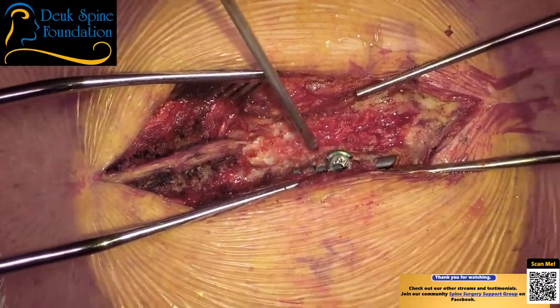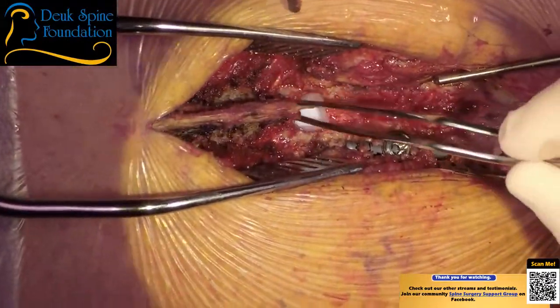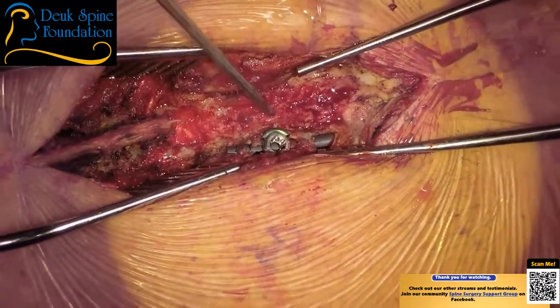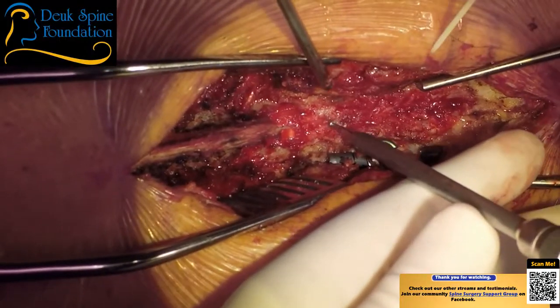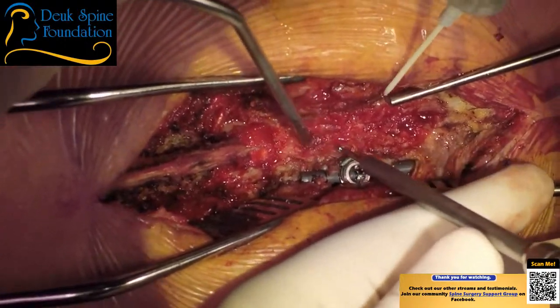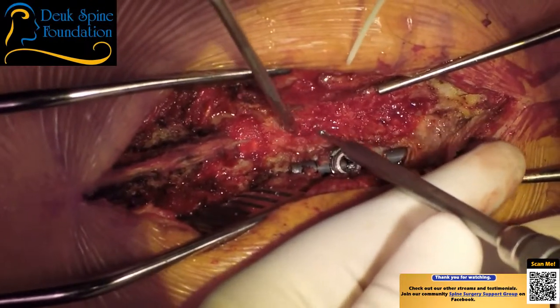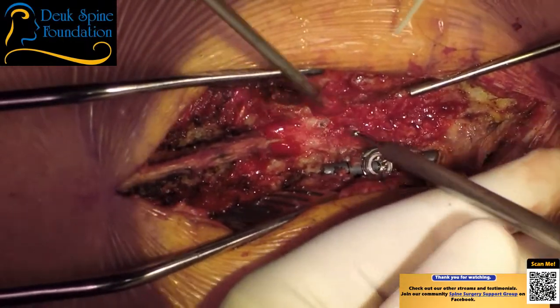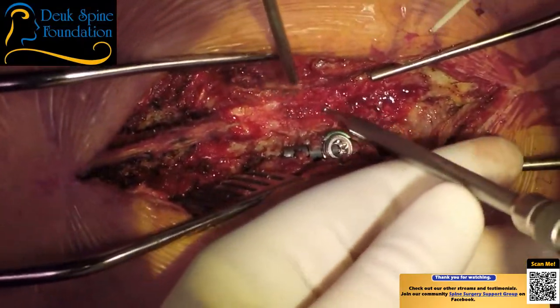So an onlay fusion, folks, is the original fusion of all time. It's where the surgeon puts bone down on top of the spine and hopes and prays that it fuses. It's a non-instrumented fusion, meaning we don't put screws and rods to support the fusion. So the likelihood of fusion goes down without instrumentation. But then the risk of complications, luckily, goes up with instrumentation. So, you know, it's one of those things that you have to weigh in your mind. Now, if his spine was just falling apart up here, then I would definitely be putting hardware.